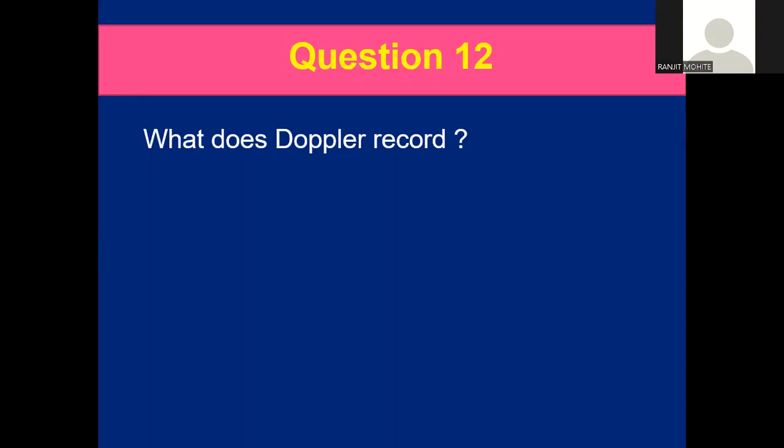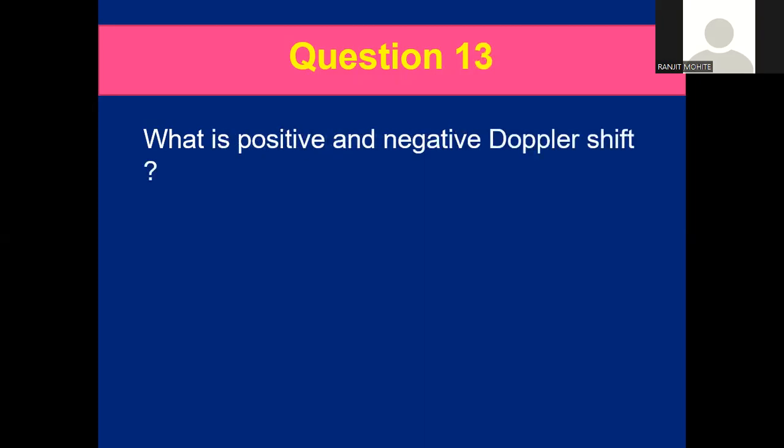And what kind of Doppler is it? Pulse wave, continuous wave, spectral Doppler, or color flow mapping? It does all of them basically. We can have a pulse wave Doppler and a continuous wave Doppler. For lower velocities, we use pulse wave Doppler, and for bigger velocities, we use continuous wave Doppler. Right. Okay.